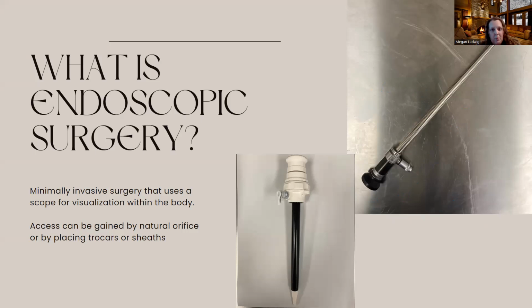We don't have to go very far. So those cameras or scopes are much shorter and much smaller, thinner, less diameter. You're just going to change based on the area that you're working on, but the concept stays the same, okay? There's always something here for a light cord adapter that will have a special cord, a light cord that goes between this scope to illuminate it to a tower or a piece of equipment, a box that you hook up to that will have the light source.